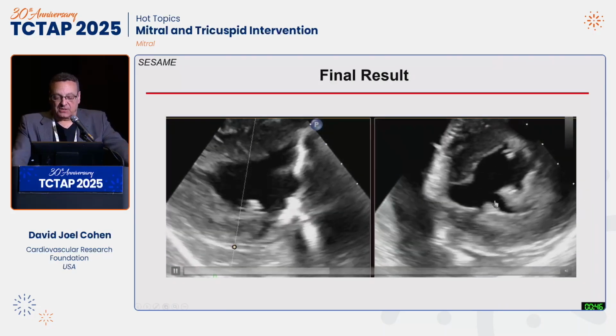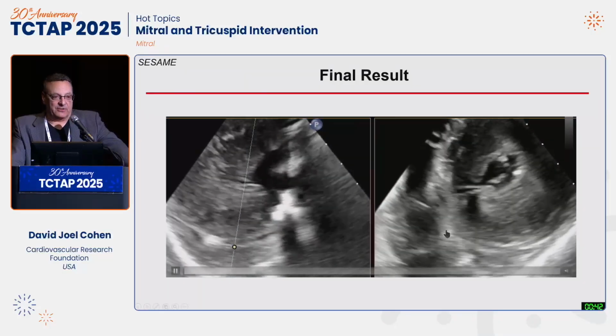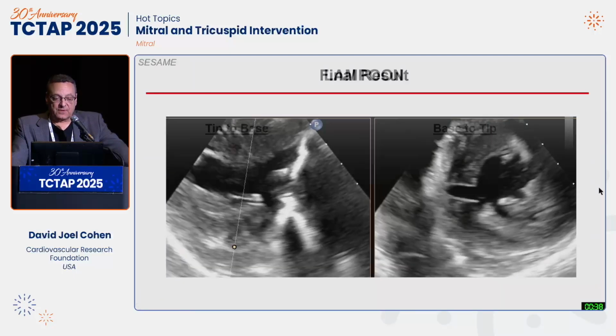Then here is the laceration being performed. And this was an amazing case. I mean, it doesn't usually look like this, but you can see this very, very nice slice in the intraventricular septum here, and it heals even better.